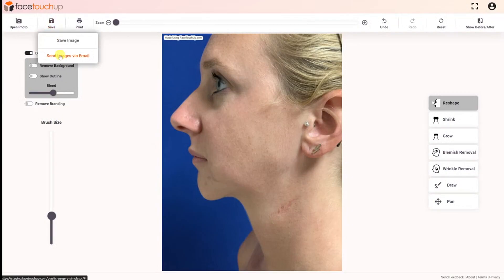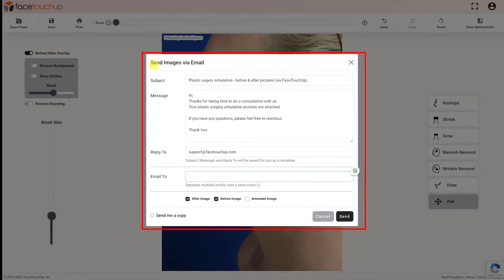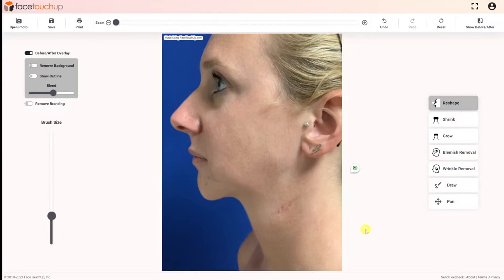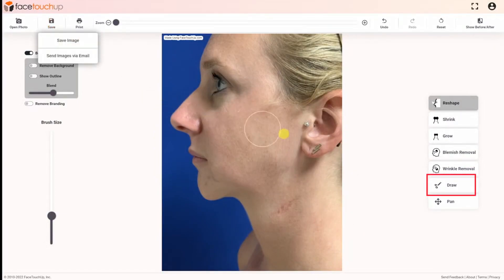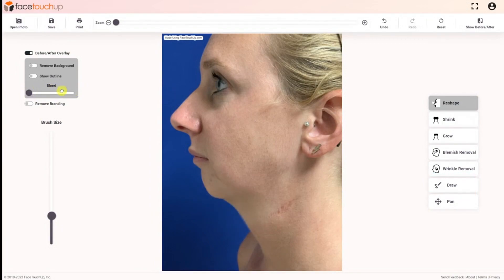Doctors with a commercial license can also send emails to patients directly from within the tool. They also have access to drawing tools that can be used to annotate the image with lines, freehand drawing, and text to highlight incision lines and add additional information to the image. This greatly helps communication with patients and helps them visualize surgery results.